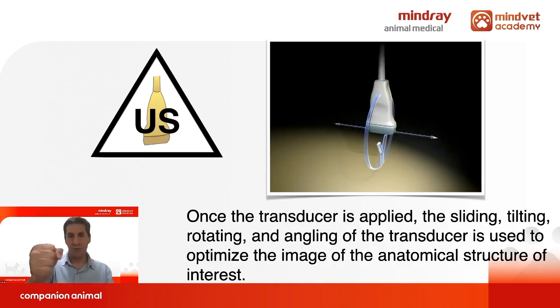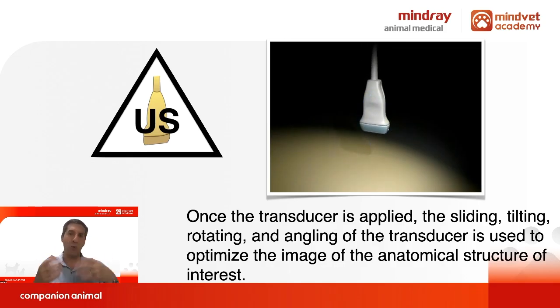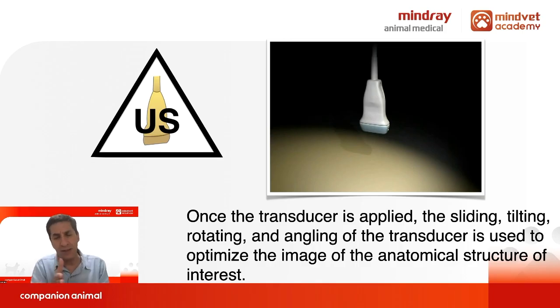We can slide the probe transversally and longitudinally to look for the place we are looking for. Movement also helps us to improve the image. Remember that the more perpendicular the ultrasound beam passes to a tissue, the more visible the structure will be.